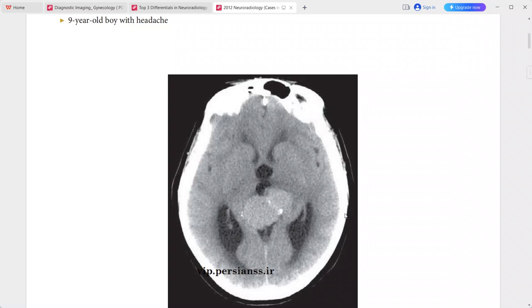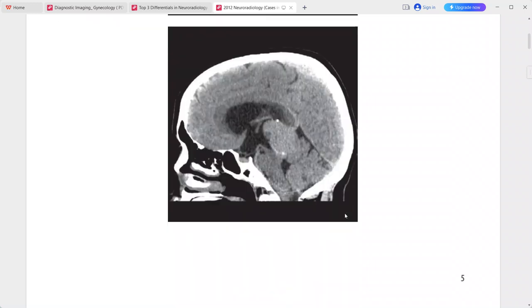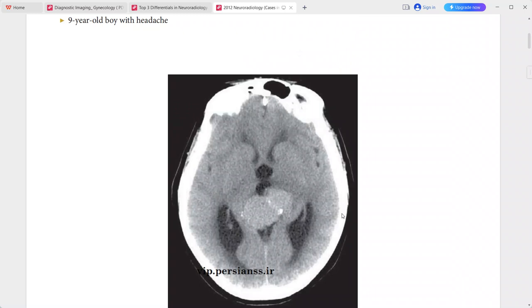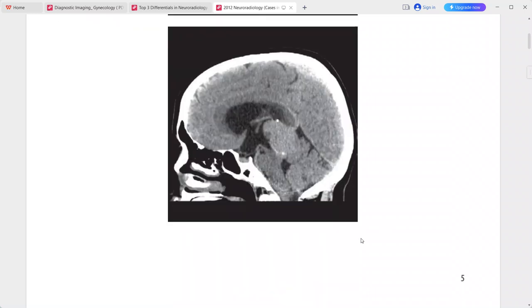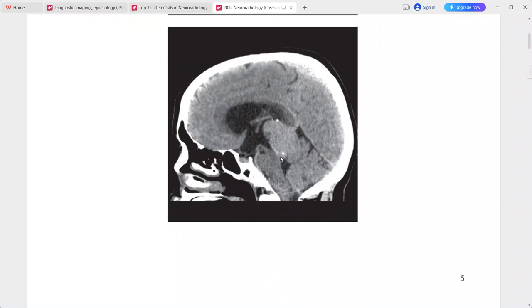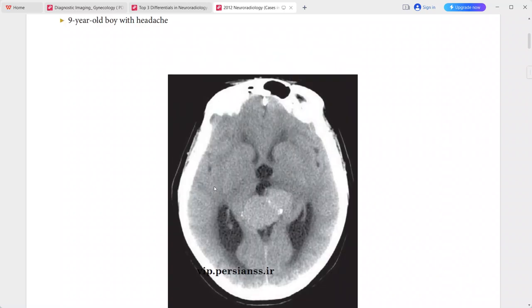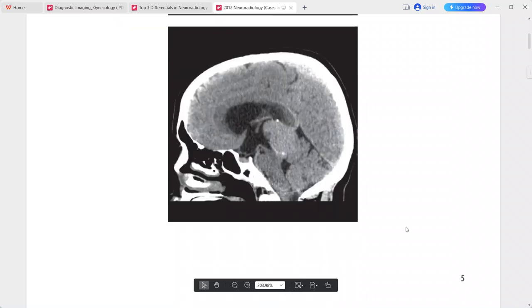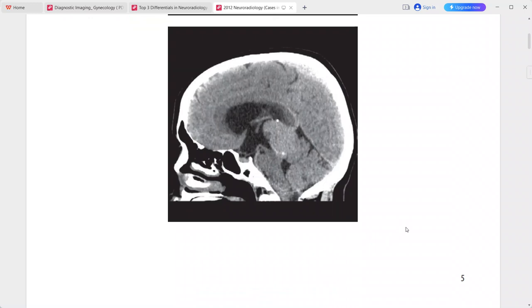There is dilatation of the occipital horns with moderate obstructive hydrocephalus due to deformation of the tectum and compression of the cerebral aqueduct. Transependymal edema is present at the occipital horns of the lateral ventricles.